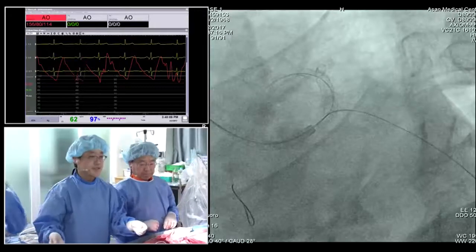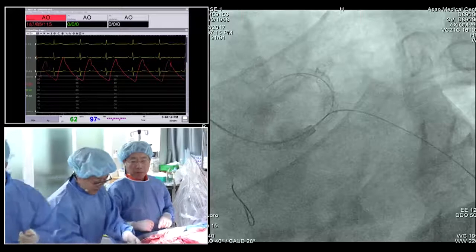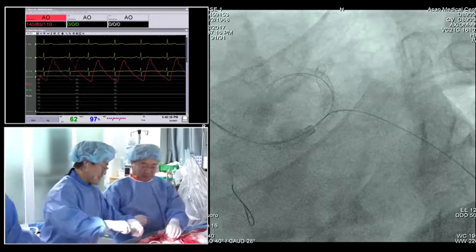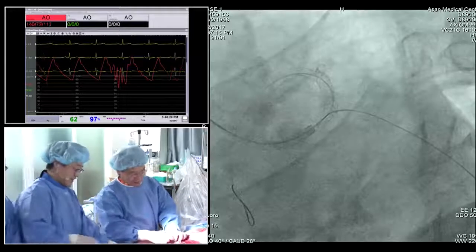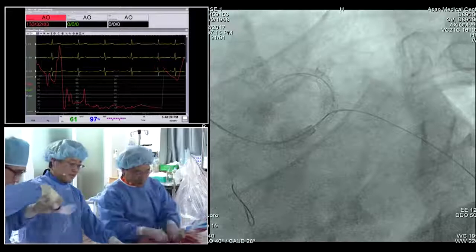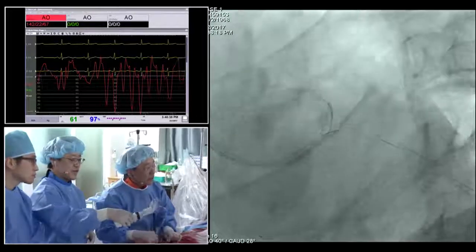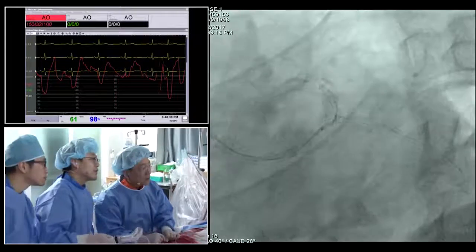3.5, use one. We may get cut off any time. Yes. We'll just watch for 1 or 2 minutes more. Anyway, before we get cut off, thank you so much for a lovely demonstration and the discussion. We may get cut off any time. All right. It's really our pleasure and an honor to join this meeting. We are very happy. This is 3.5 non-compliant for the anchoring. This is useful.